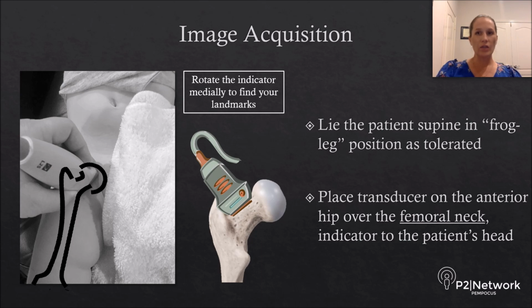With the patient lying supine, identify the greater trochanter on the anterior aspect of the symptomatic hip of the patient. Place the linear probe in the sagittal oblique plane parallel to the long axis of the femoral neck, with the indicator towards the patient's head. Locate the femur with its characteristic hyperechoic periosteum and posterior acoustic shadowing. Use the femoral head and the slanting neck as a landmark, and identify the hyperechoic fibrous joint capsule.